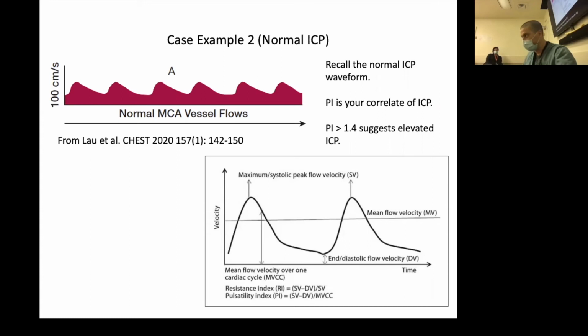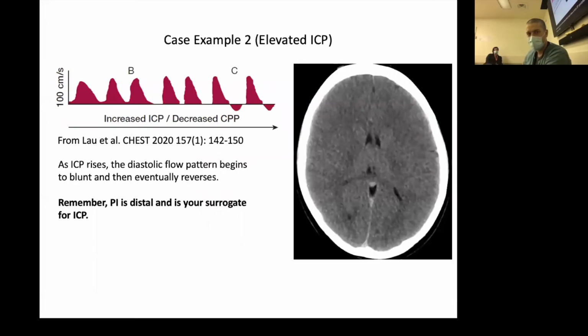So what you might see in a guy like this, as you do his first one, is you start seeing this blunting of your diastolic velocity. It turns into this kind of like rolling hips, okay? And when you lose your diastolic velocity, as we demonstrated in the general systems ICU a couple times this week, you know that your ICP has to be higher than your diastolic blood pressure because it is gone, and you're only getting peak systolic jets, and all the diastolic is gone.